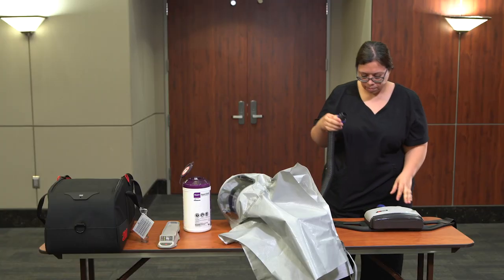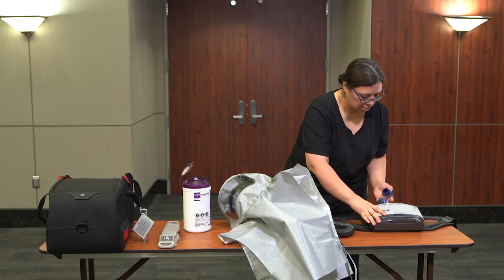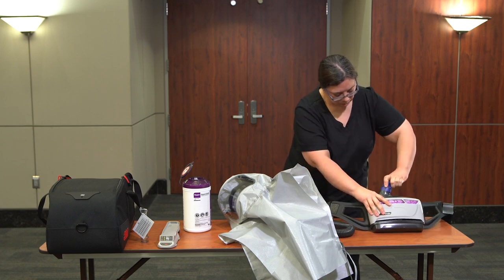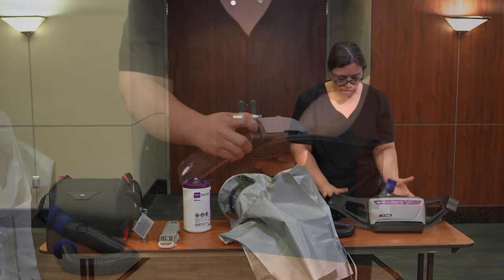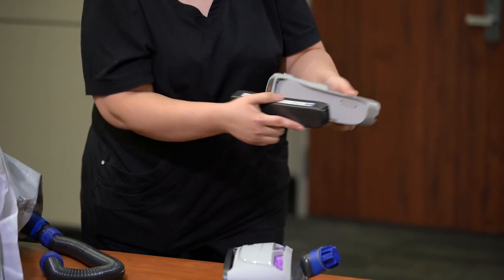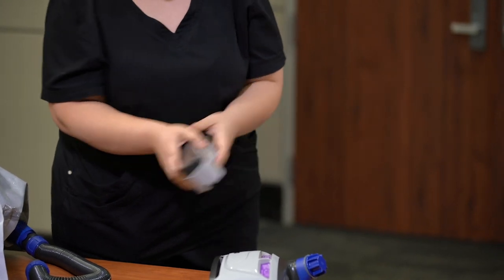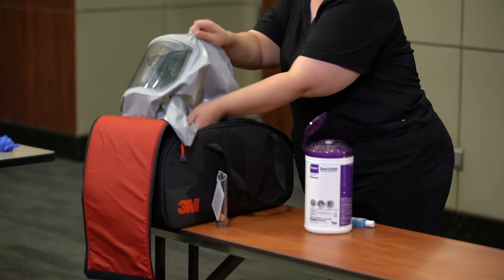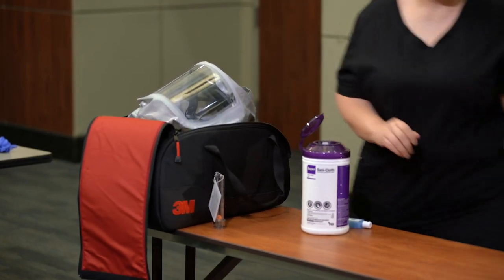Disconnect the hose from the blower assembly. Place the protective cover on the airflow port of the blower assembly. Disconnect the battery from the blower assembly and place it back on the charger to charge. Return all components to the PAPR bag and store the bag on a clean surface.